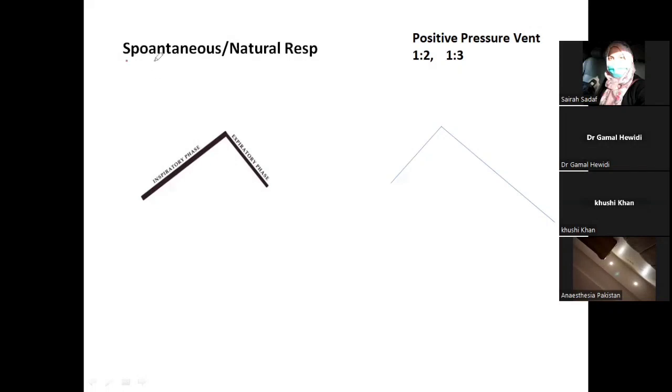When the patient is taking spontaneous respiration, it is negative pressure. That's why I mentioned earlier in my slide that spontaneous respiration is a negative pressure ventilation. So during inspiration, intrathoracic pressure decreases. It won't affect the hemodynamics, the cardiac output, or the venous return.